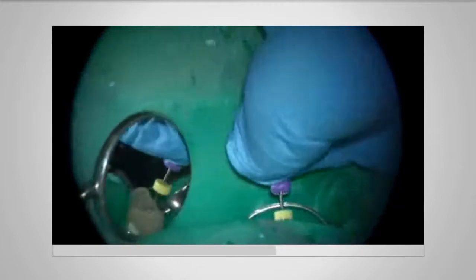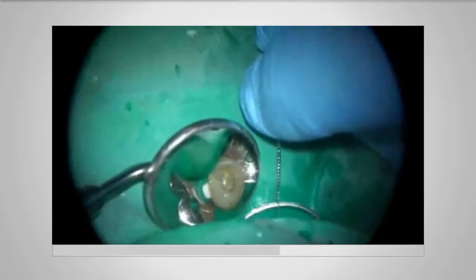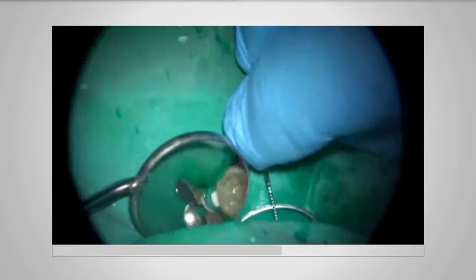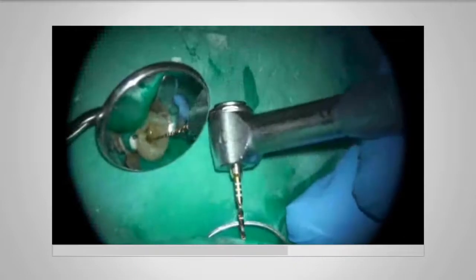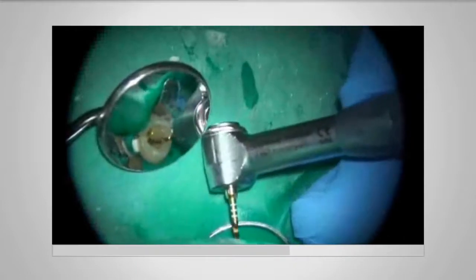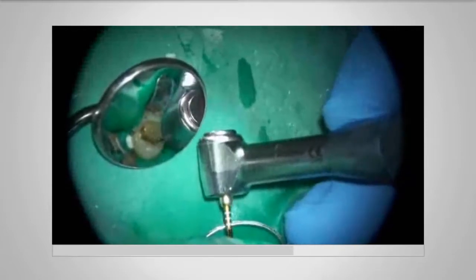And I'll be irrigating again, making sure that any dentine chips that I've created are flushed up into the access. Now I've done that and I've got a reproducible glide path, I can rapidly taper the root canal system, in this case using Wave 1 Gold reciprocating instruments.